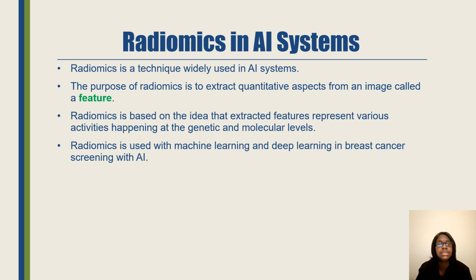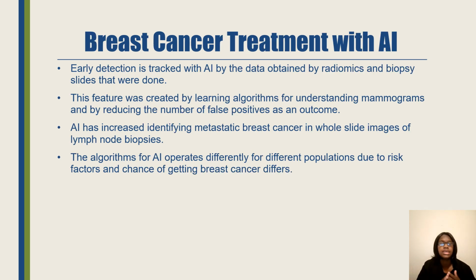We have radiomics in AI systems, the purpose of which is based on the idea that whenever you are using that machine learning and deep learning, it's going to be very helpful in breast cancer screening. It does extract features representing various activities happening at the genetic and molecular levels. For breast cancer treatment with AI, it is going to help increase identifying those metastatic breast cancers, and it will help reduce the number of false positives as an outcome.